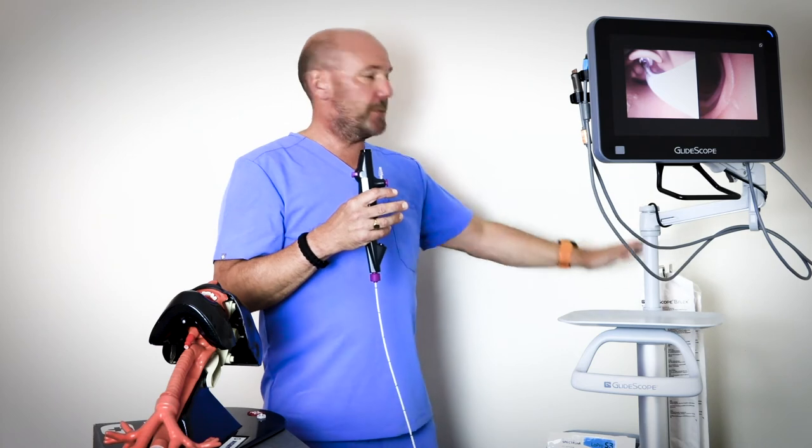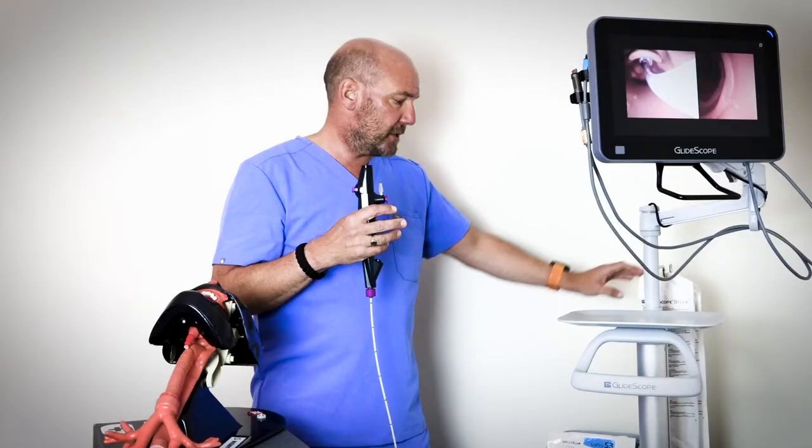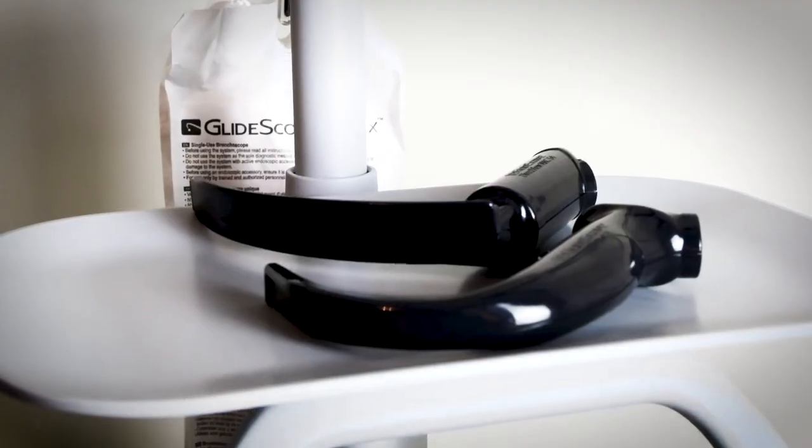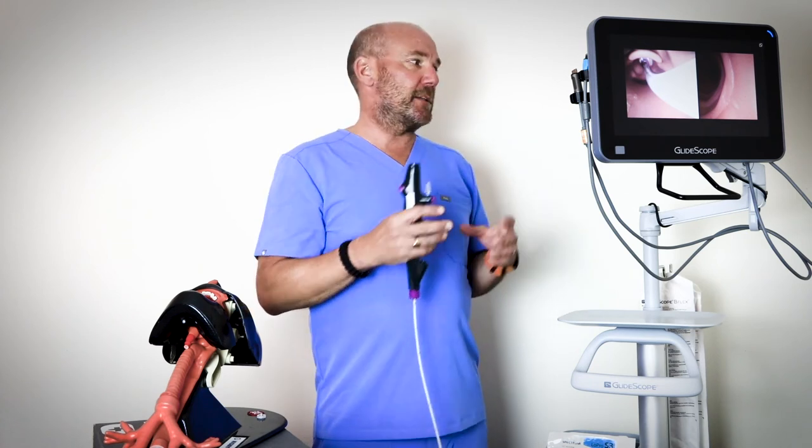In terms of the workstation itself that the monitor sits on, we have a nice cable tidy, a hook for the Bflex bronchoscopes, and nice trays for all your tools — a prep tray and a disposal tray. So it really is a total all-in-one airway solution, whether you want to manage an airway with a laryngoscope or a bronchoscope, without having to switch over systems.